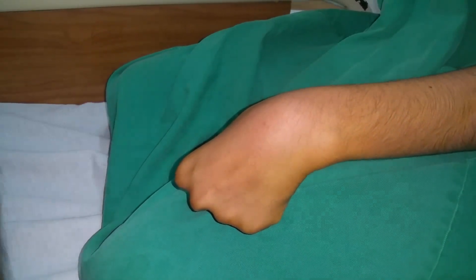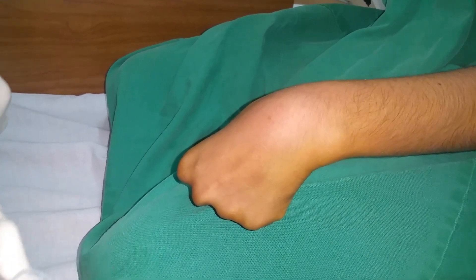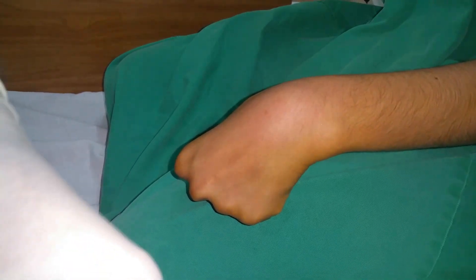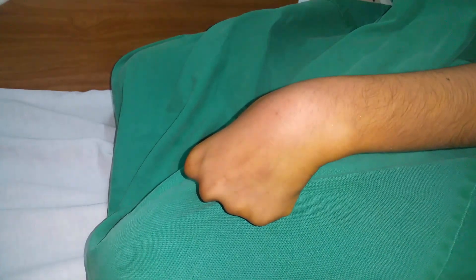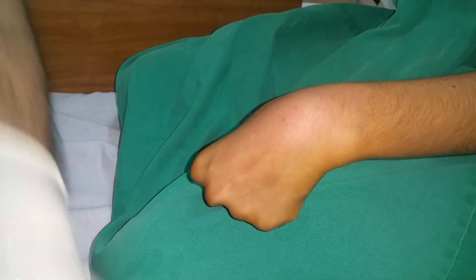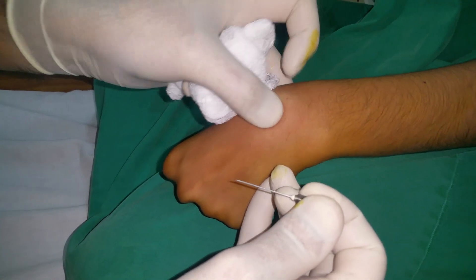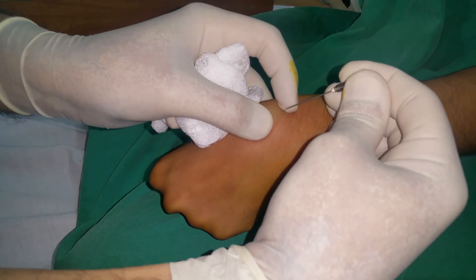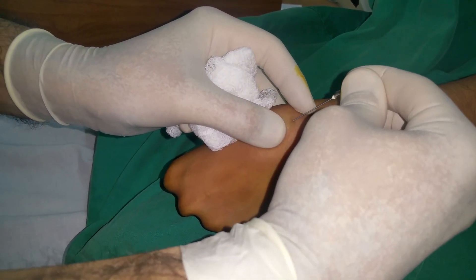At the same time, we secure the cavity with another needle which will be used for injecting the steroid into the space which will be aspirated first. So this is our technique. We have localized it. We are introducing a needle which will be used for injecting the steroid later on.